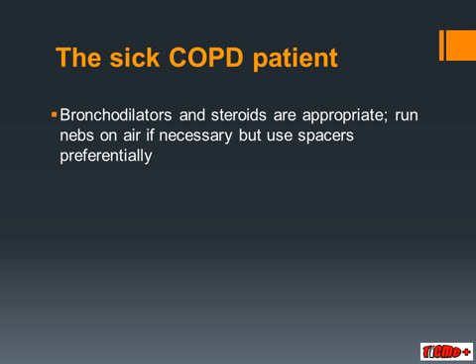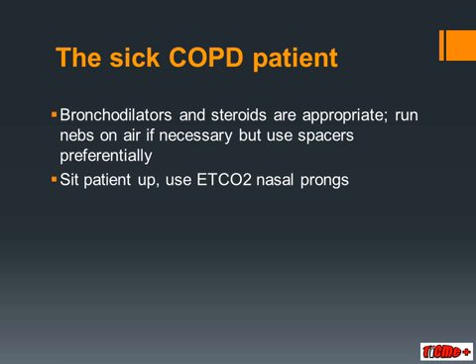Remember that you can run nebulizers on air and you can keep the nasal prong oxygen so you can titrate the FiO2. We'd prefer to use spacers whenever possible, as they confer a lower risk of droplet spread disease transmission.